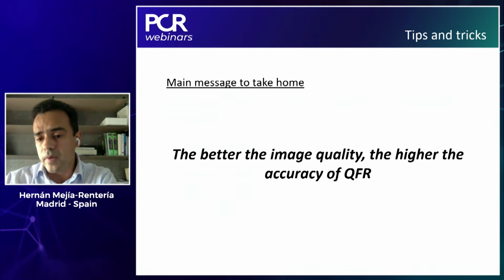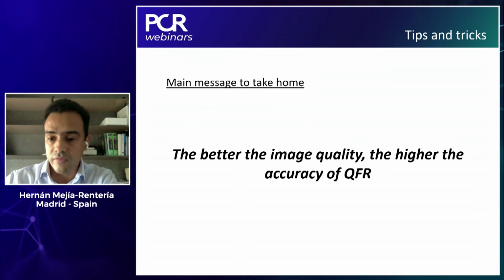And this is my final remark. The main message to take home for me is this: remember, because it's very important. This is the cornerstone of QFR. The better the image quality, the higher the accuracy of QFR.